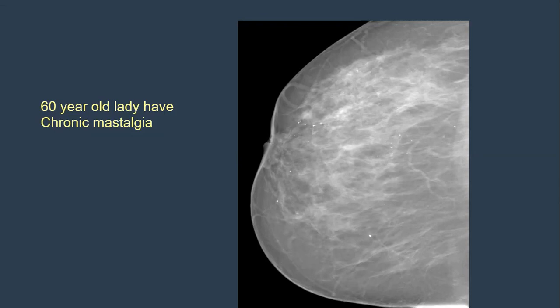Okay, the ultrasound doesn't show a mass. It demonstrates some distorted ducts, mildly dilated, ductectasia, with some thickening of the walls and beaded appearance, and some echogenic areas going toward the skin and areolar skin. It might represent an inflammatory process.